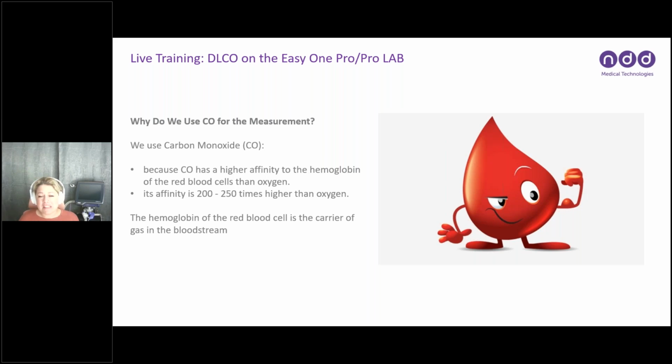It is a very, very safe test. If your patients ever have questions about breathing the test gas, you get more CO probably sitting in 5 o'clock traffic or 8 a.m. traffic, whichever you are closest to. This is even safe for pregnant women to do. The amount of CO is so minimal, and we do wait between each DLCO trial to allow the body to naturally expel that CO. So when doing the test correctly, there's no profound risk to the patient whatsoever.